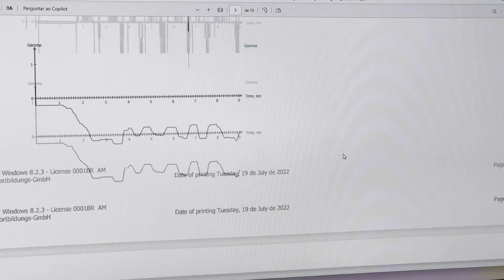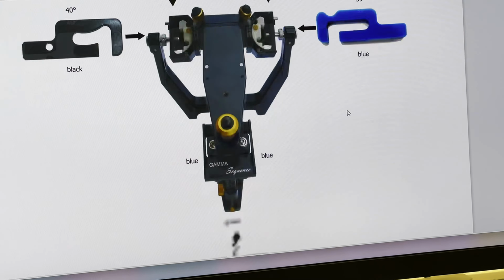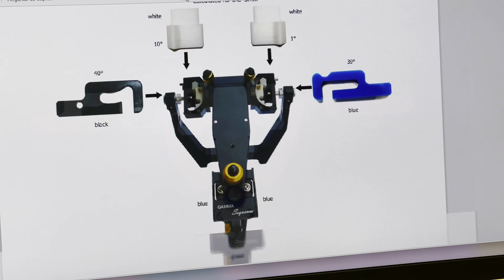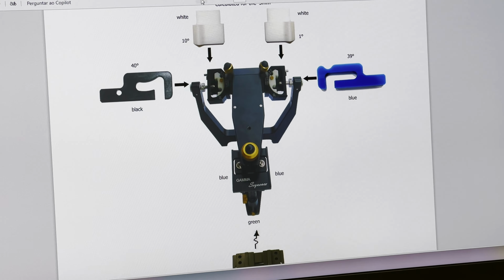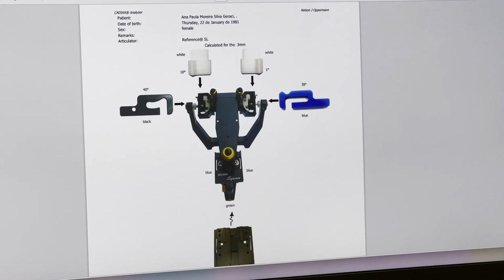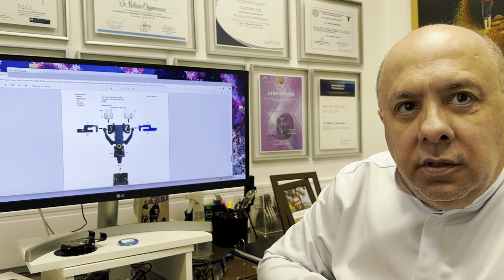So in terms of function on condylography, I will go here. The system on Slavicek concept, after I do condylography, tells me how I should mount the articulator according to the curves and the function of the joint. So how this articulator will be mounted.